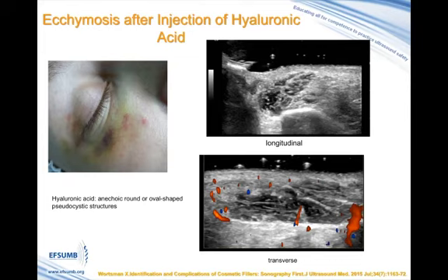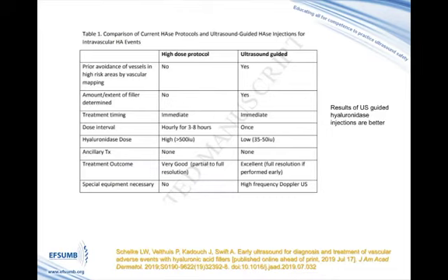It is now well documented in the literature that the results of the ultrasound-guided hyaluronidase injections are much better than the blinded injections of hyaluronidases.